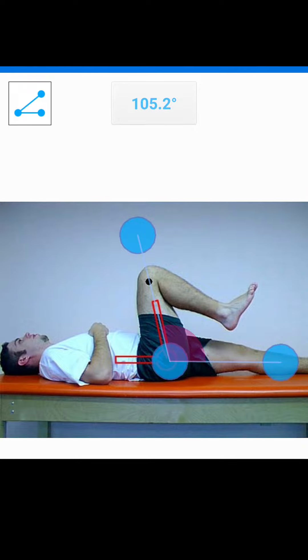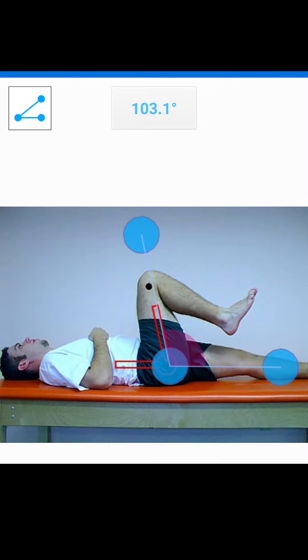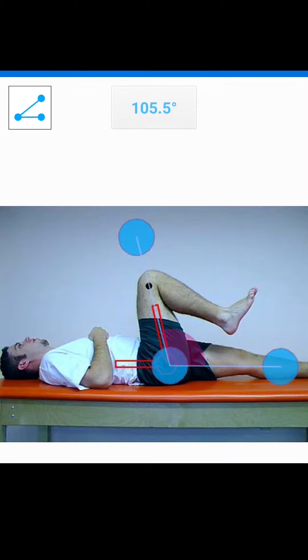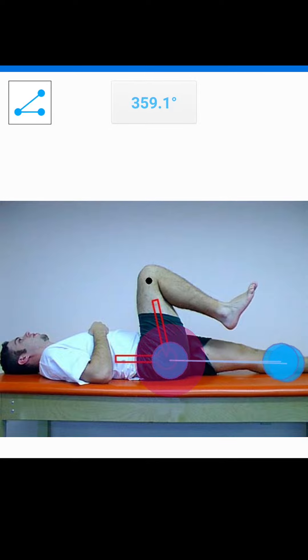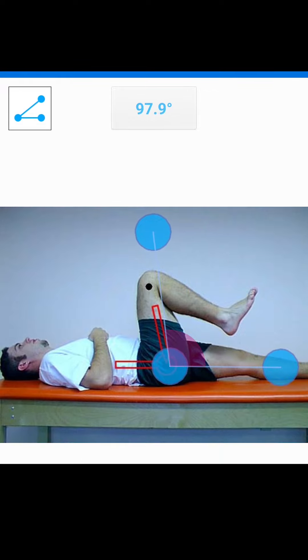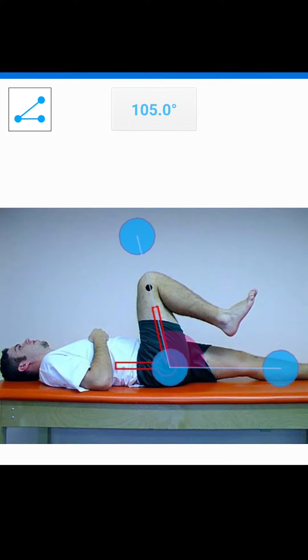Now you can see it's reading 105.2 degrees — this is the way that you're going to measure it. You need to think about where did my limb start, what range of motion did it move through, and where did it end? Think of your start position, and your start position needs to be as close to zero degrees as possible. They move through that range of motion, and I'm capturing that inner portion. So this is about 105 degrees of hip flexion.